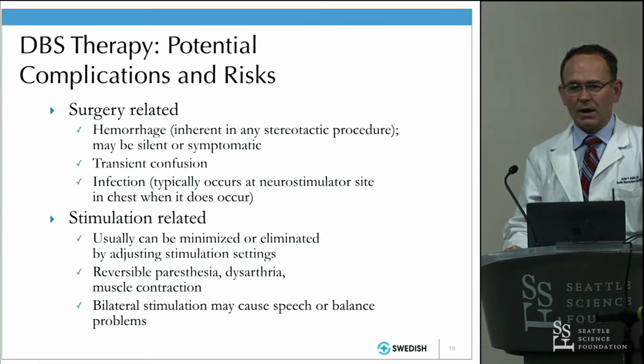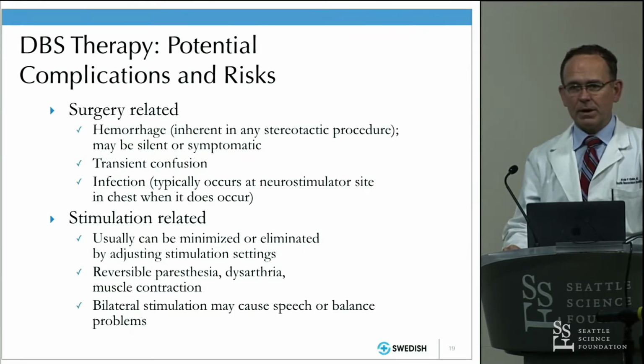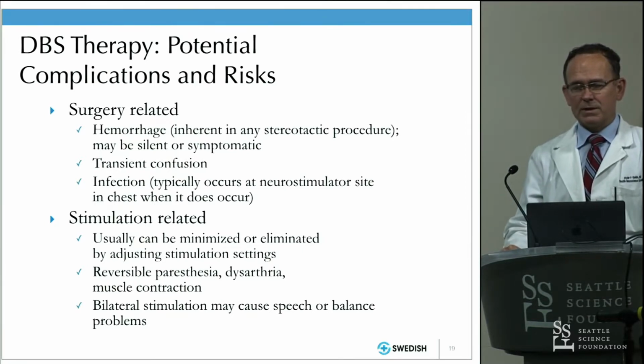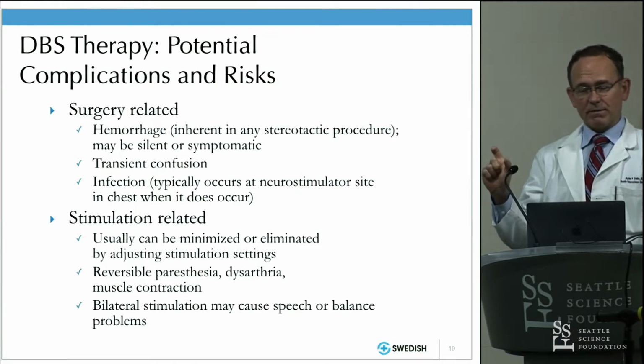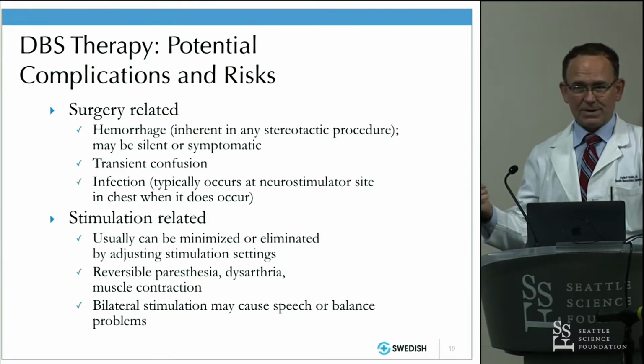Well, the answer is yes, there are side effects that can occur with ablation, and I'll talk a little bit about that in a minute. But the question is whether it's ablating the VIM that's causing the side effects or whether you're spreading that ablation into nearby structures that are causing the side effects. But obviously, it does something.